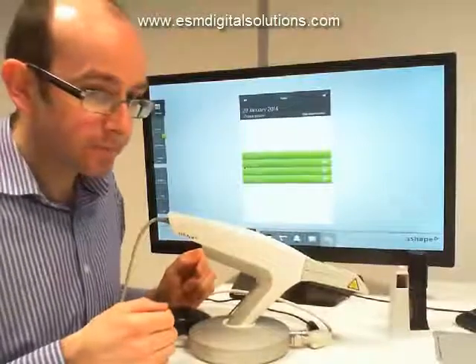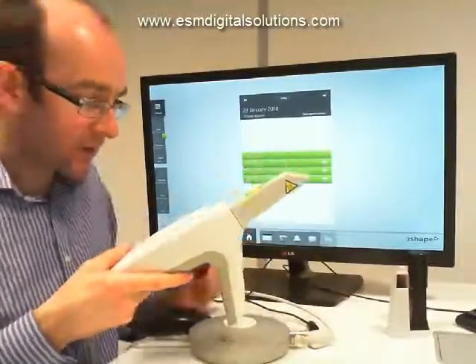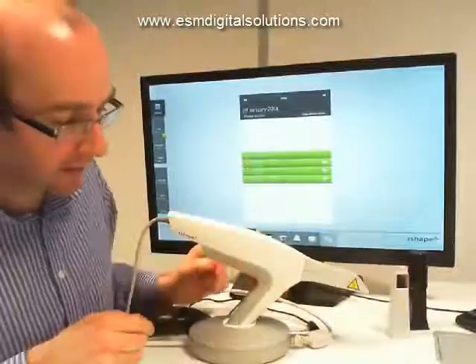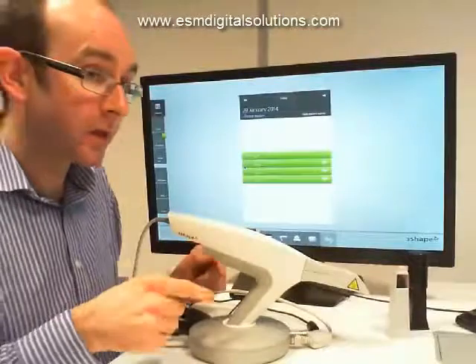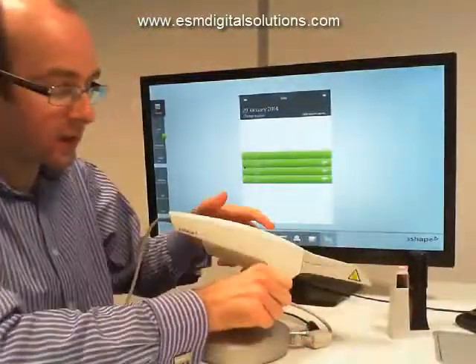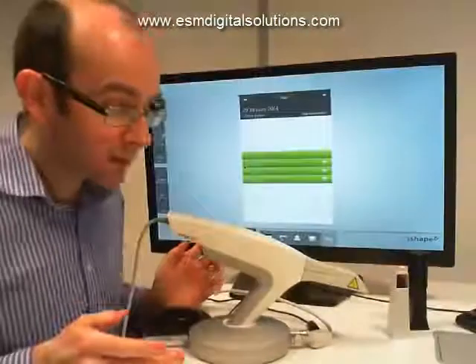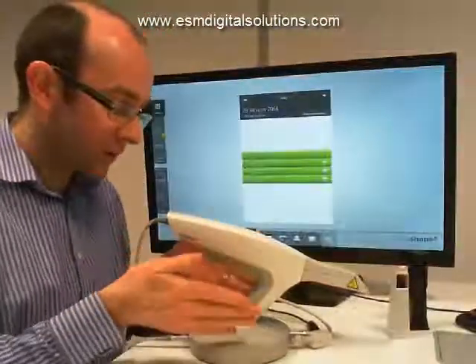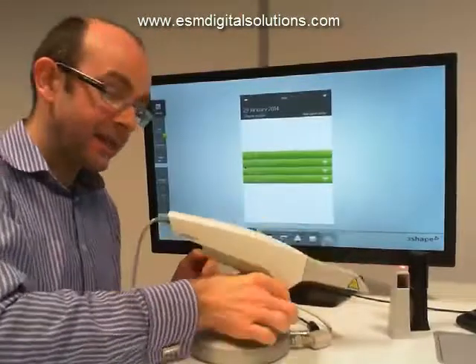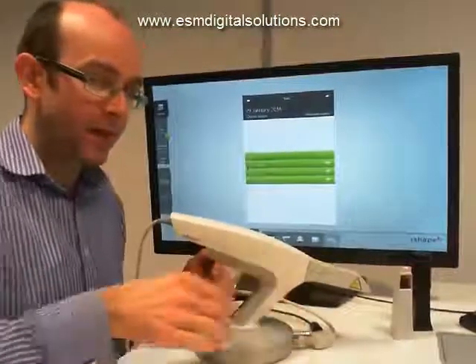The scanner sits in the pod using this hole. The hole is at an angle, which means the scanner can only go in in one orientation. If we try to put it in a different orientation, there is a strong risk that the scanner could fall. So we just make sure when positioning the pod in our work area that it's positioned so we can easily take the scanner out and put it back in again.